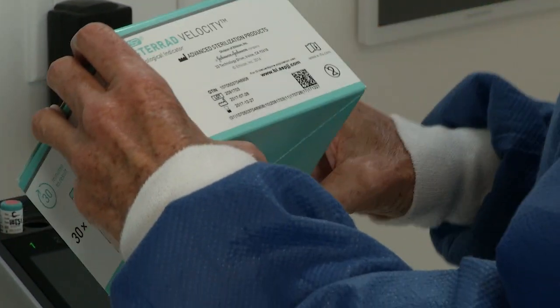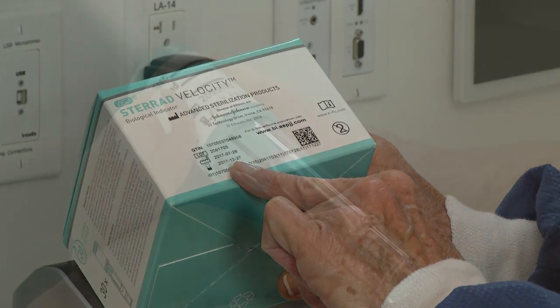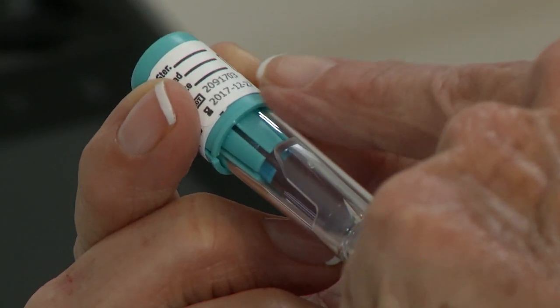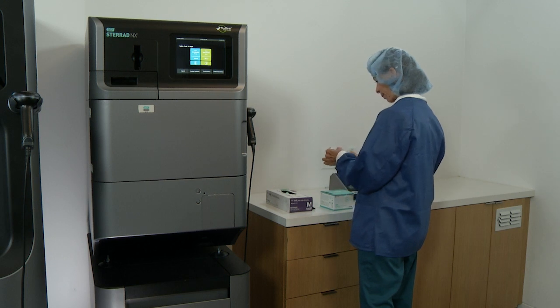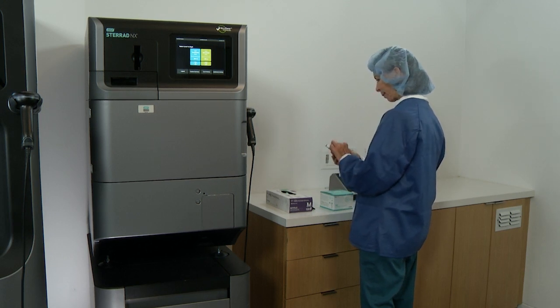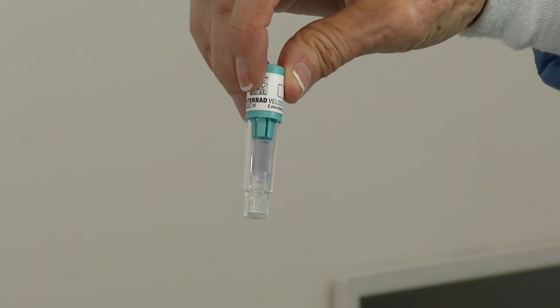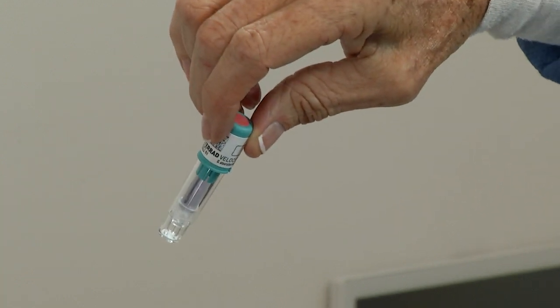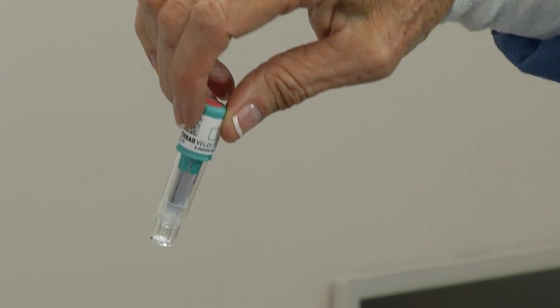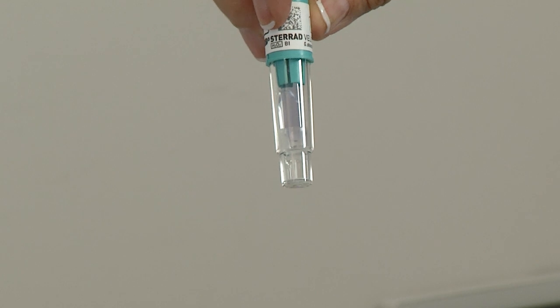Always check the expiration date on the STERAD Velocity Biological Indicator box, as well as on the individual vials to be used. To ensure that the integrity of the ampule has not been compromised, inspect the test vial to confirm the following: the growth medium is purple, the ampule is intact (meaning not broken or cracked), the chemical indicator, or CI, on the cap is red-pink, and the spore disk is lying horizontally in the bottom of the growth reservoir.